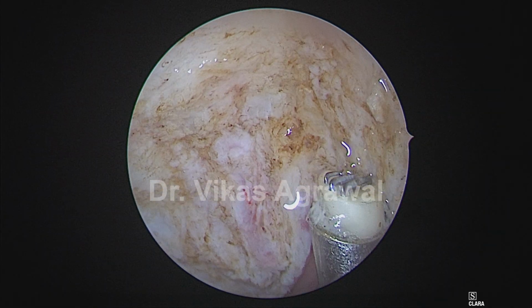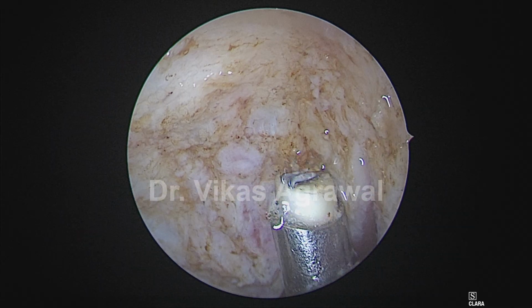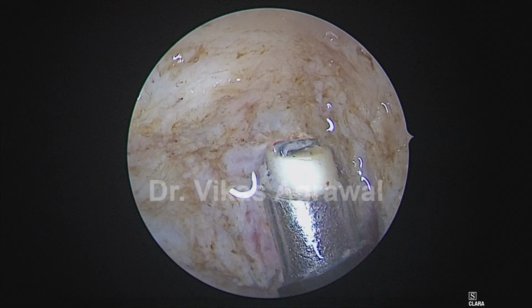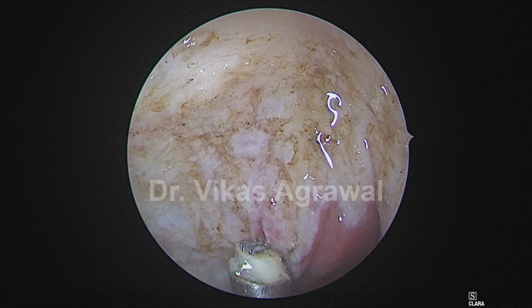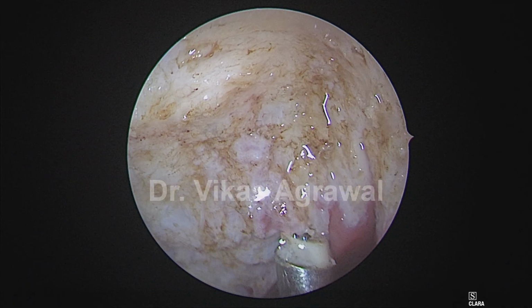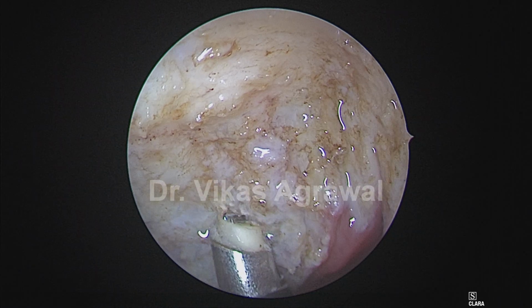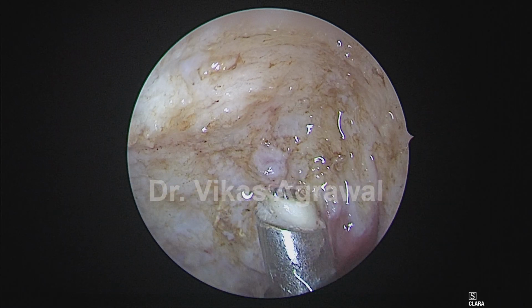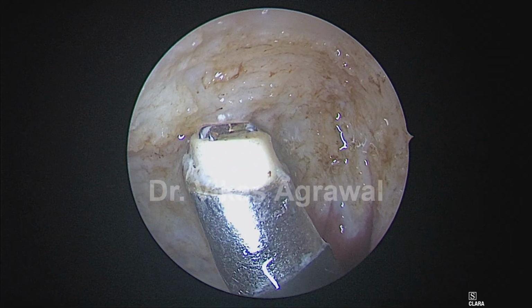not directing our wand laterally. We'll remain superior or medial so that we do not accidentally open up any blood vessel, which is a direct branch of the carotid. Generally, if there is something, you will see a pulsation, so it will guide you that there is an aberrant vessel.